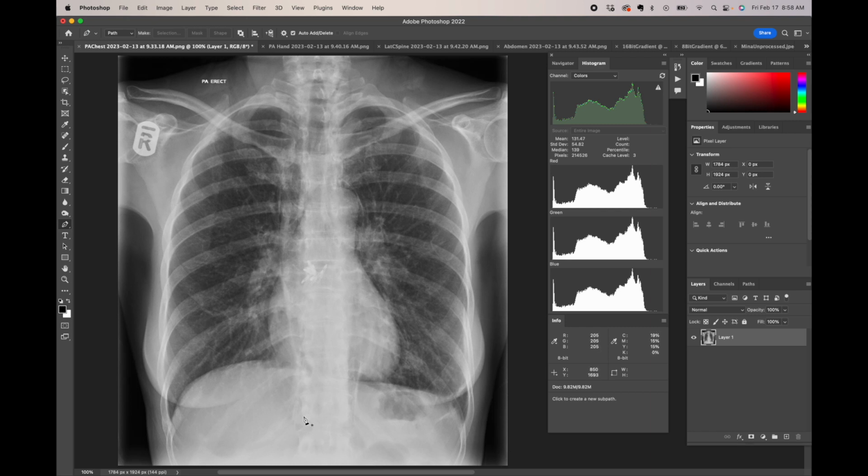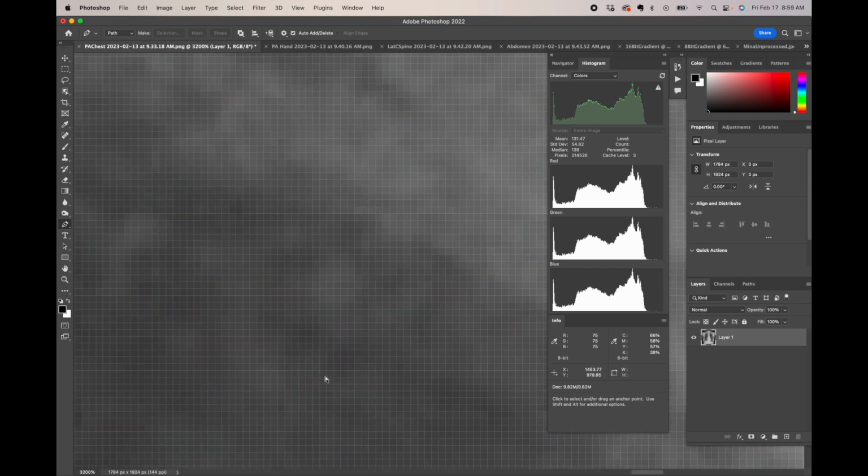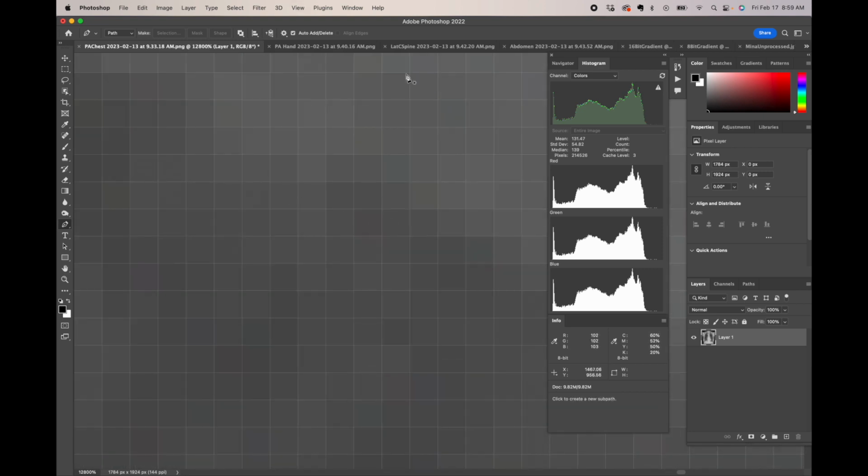This first one is your textbook perfect chest x-ray. I'm first going to zoom in, and basically we were taught recently that what you see here is a matrix of rows and columns of pixels. I'm going to zoom in real quick and you start seeing the pixels there. I'm going to zoom in more. As you can see, each pixel is a specific shade of gray. You don't see two different tonalities in a pixel, it's one individual shade.